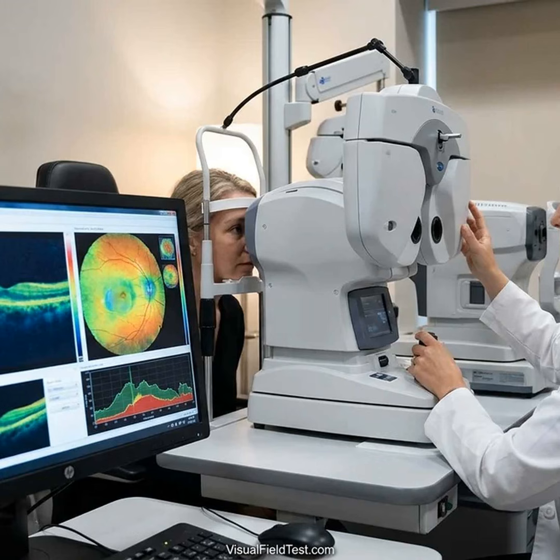In fact, when vision is very poor, OCT of the macula can spot issues, macular degeneration, diabetic changes, epiretinal membranes, that need treatment to preserve remaining vision. So in advanced glaucoma, OCT use shifts toward protecting what's left, not just measuring glaucoma.